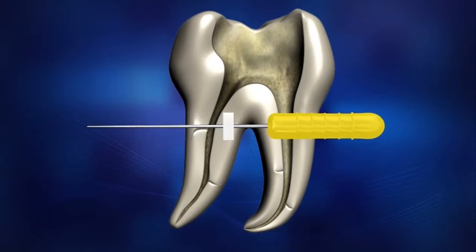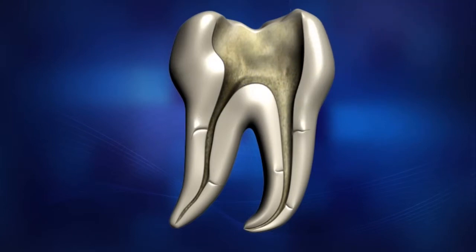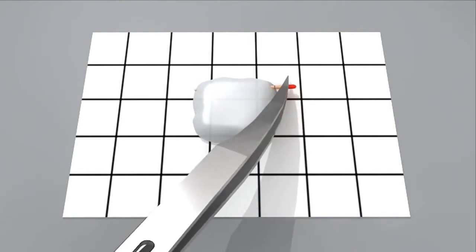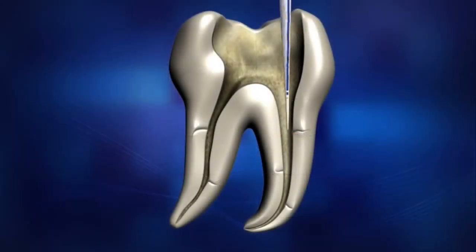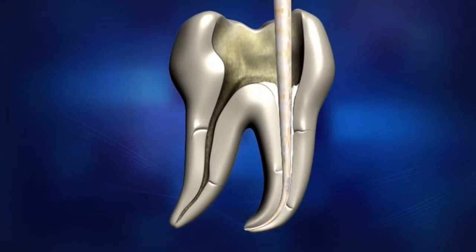To select an appropriate size for the hand plugger, insert the hand plugger and match it to the Diapen tip size. Coat the fitted master cone with sealer and insert the cone repeatedly into the canal 2 to 3 times. This will help eliminate any gaps between the Gutta-Percha and the surface of the canal.